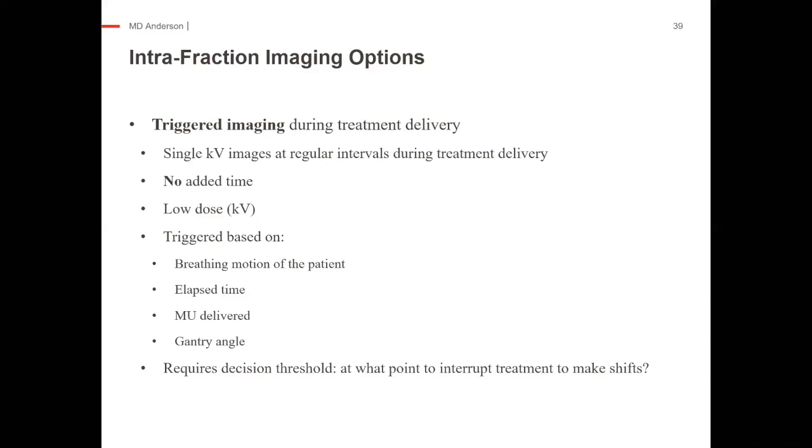So this requires a decision threshold though. So you're taking these images during treatment. At what point do you interrupt your treatment to make your shift? Do you say if it's a 1 millimeter shift, you continue treating? If it's a 2 millimeter shift, then you interrupt and make that shift and then continue. So this is a decision threshold that you individually would have to make.